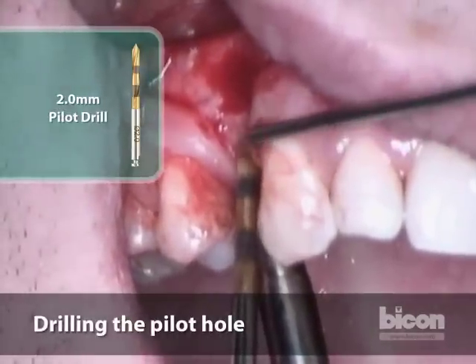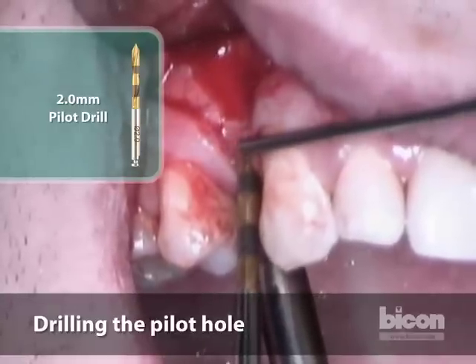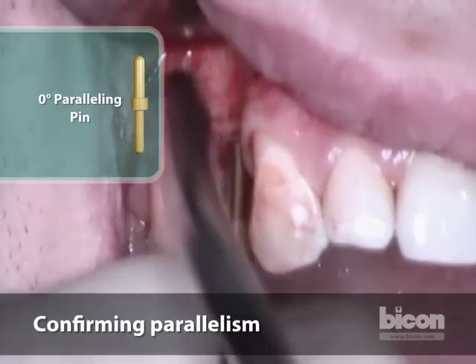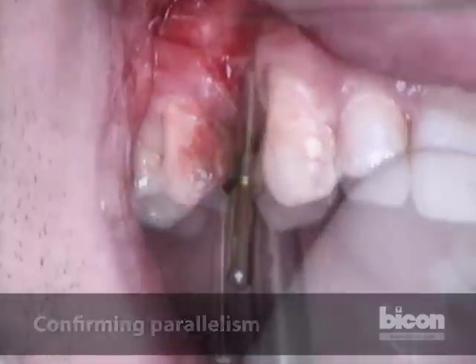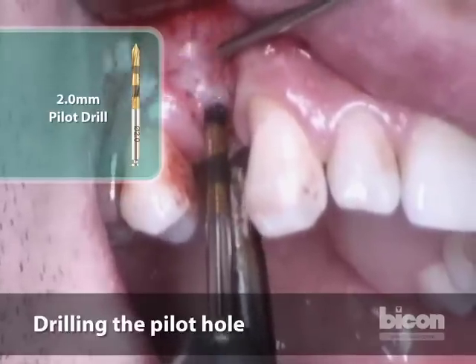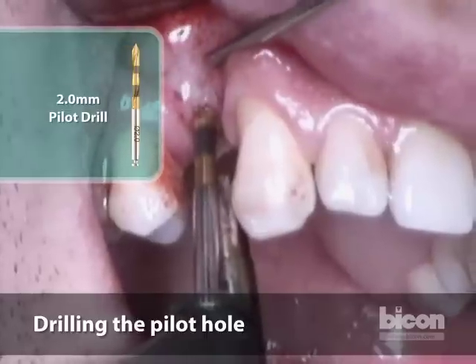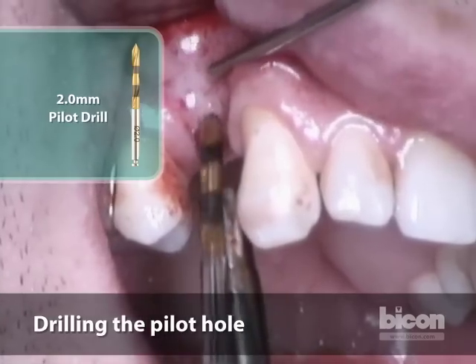Since we are placing an implant about 6 to 8 millimeters in length, we will make our osteotomy — the initial pilot osteotomy — to a depth first of 6 millimeters to make sure that our location and angulation is acceptable. Slightly angled mesially, we can easily rectify that. We are now at 8 millimeters. The bands on the BICON instrumentation are between 6 and 8, and then between 11 and 14. I don't want to reach the second band because that will mean I've gone into the sinus. We are now at roughly 9 to 10 millimeters.